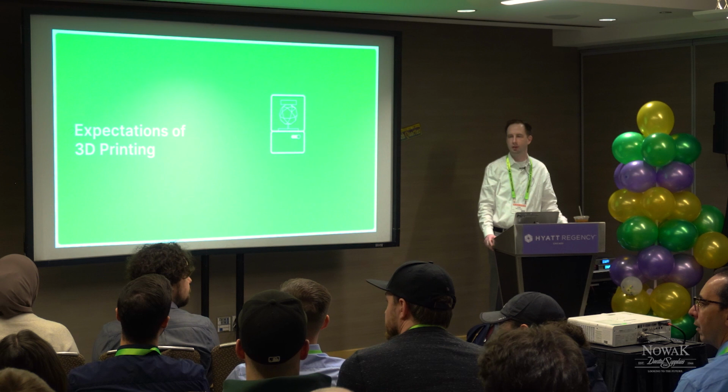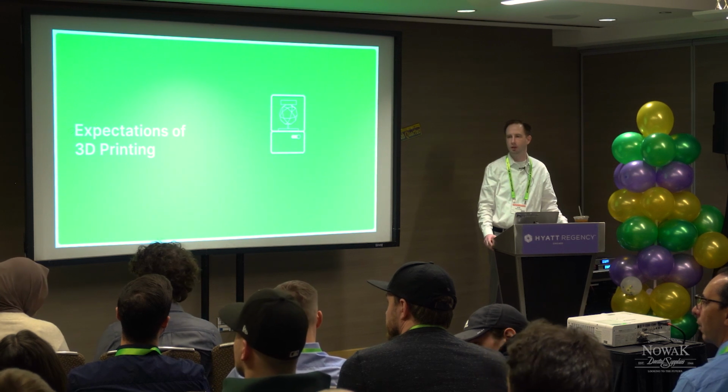Yeah. So how do you test the advertised strength of zirconia? So without being able to meet the ISO standard, because there's a long PDF on the ISO standard that all these materials should be set at, is actually quite onerous.